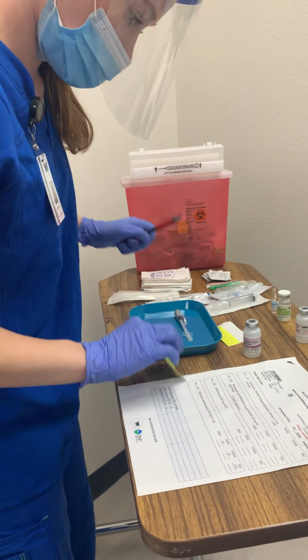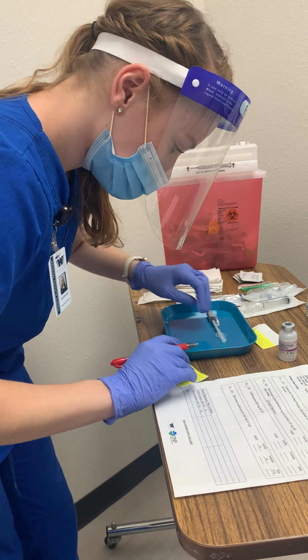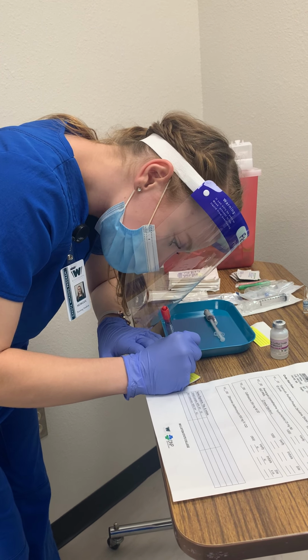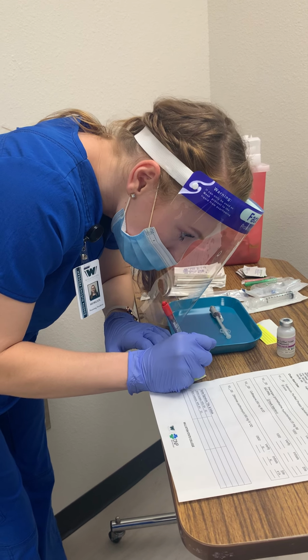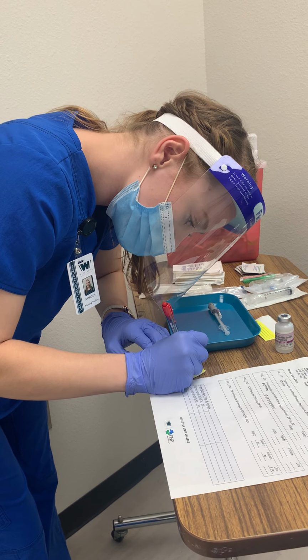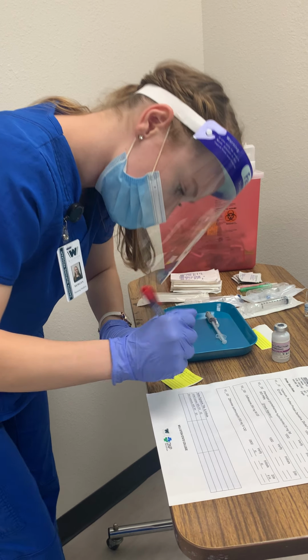And then I'm gonna be double checking, so this will be my second check, making sure that I have what I need. I've got tuberculin, dosage 0.1 mL, 1 dose, and initials, and it's currently 9:48. So perfect.